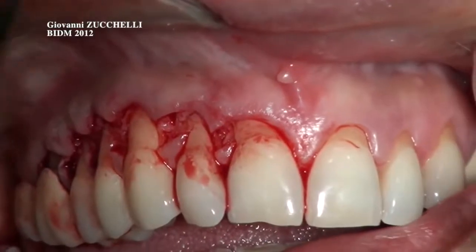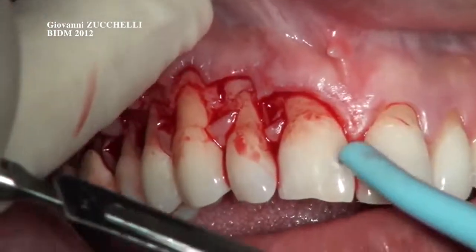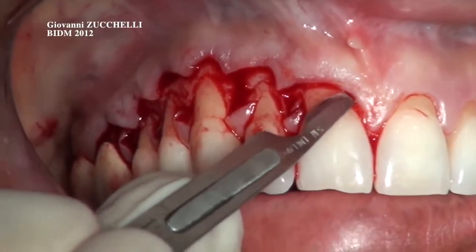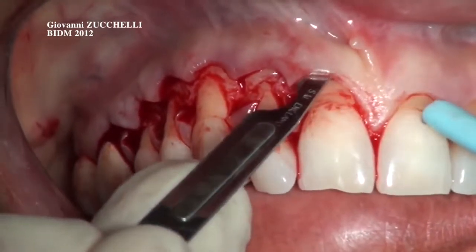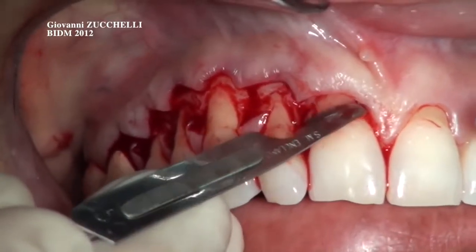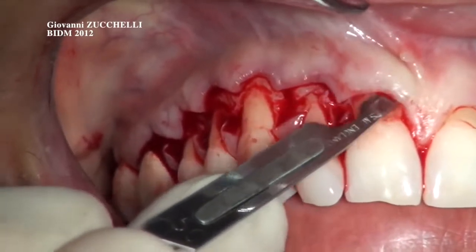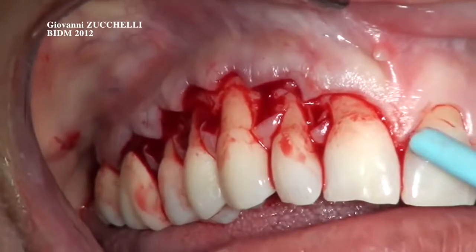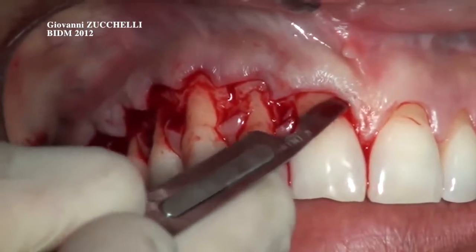You have to do this deep thickness incision parallel to the bone, below the mean frenulum. This is quite difficult. You have to be very careful not to perforate here. You must go further mesial. I'm detaching the deep insertion of the mean frenulum in such a way. And now you can go superficial, please.